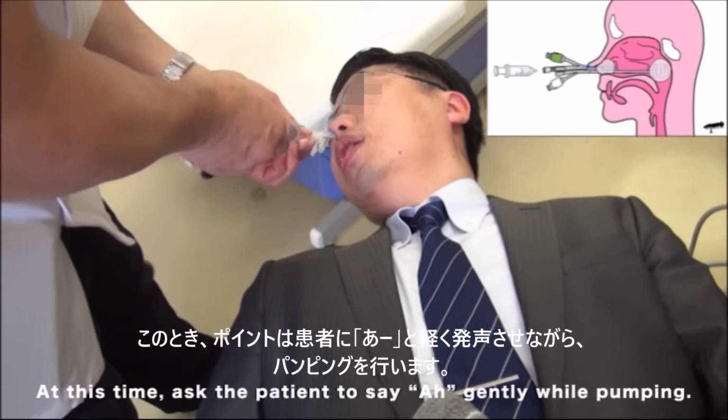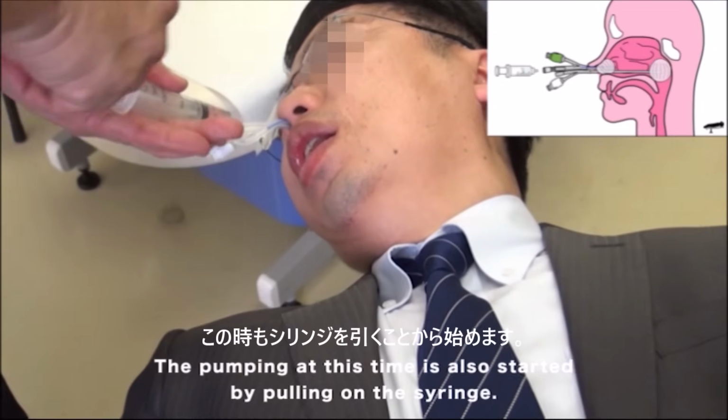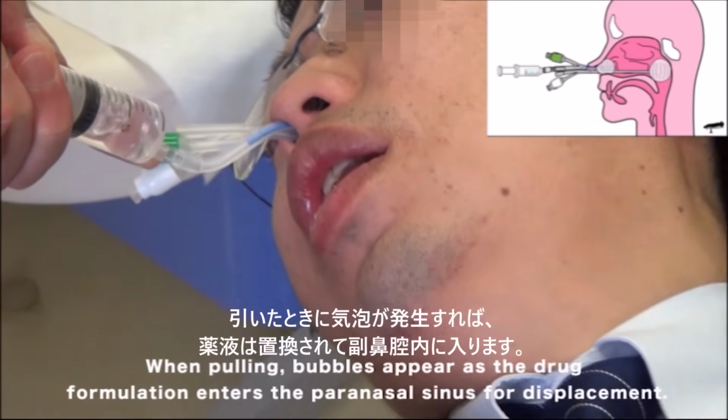At this time, ask the patient to say "ah" gently while pumping. The pumping at this time is also started by pulling on the syringe. If you push the syringe at this time, you risk losing the airtight state.